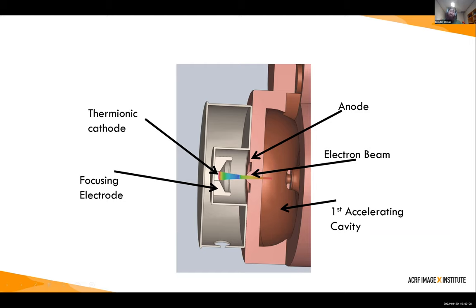The source of RF energy is something I took out of the talk. The two primary devices used to produce RF energy are the magnetron and the klystron. You can almost think of these as an accelerator in reverse — they use quite a high current, modulate it, and because of big bunches moving they produce their own RF. We have a high current producing RF, and then the RF is used to accelerate a lower current to a higher energy. I sometimes think of it as analogous to a transformer.